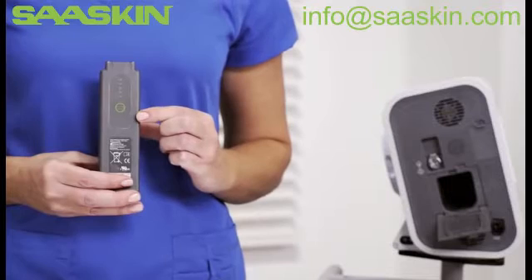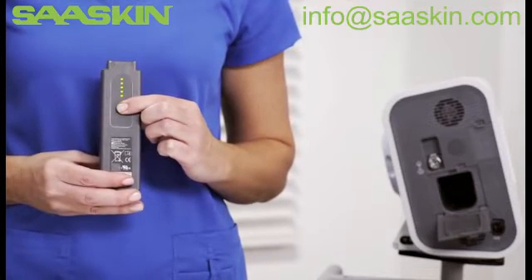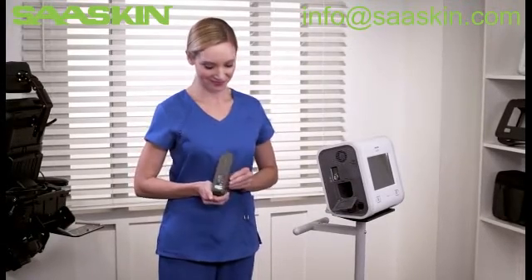To view the percentage charge, press the button on the battery. To replace the battery, slide it into the bay until it clicks into place.